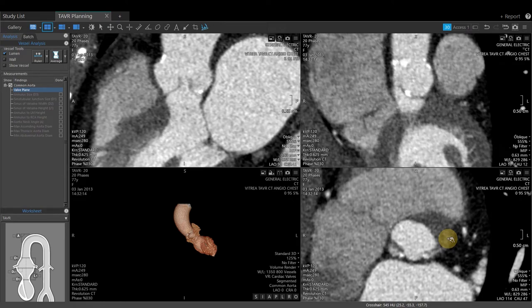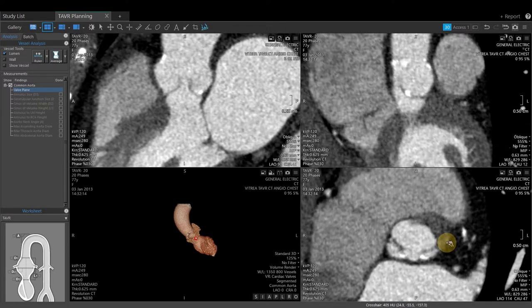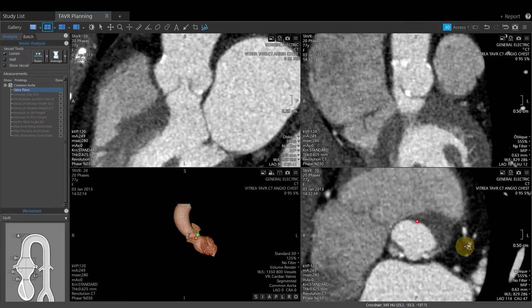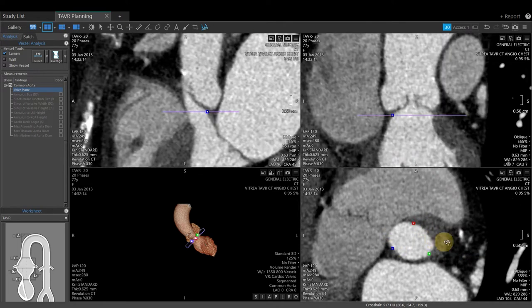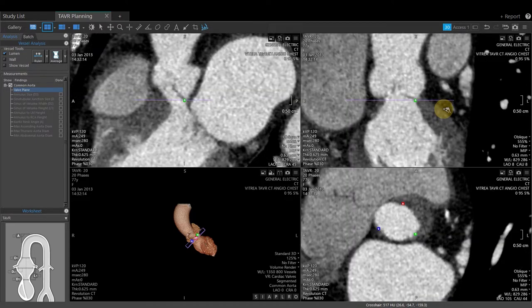Once the valve inserts into the aorta, drop a single click where it disappears by left-clicking. Note the red box in the axial image — red is for right. Then mark the left coronary cusp with a left click, then mark the non-coronary cusp. Once all three points are created, a purple valve plane appears on the MPR images. You can still manipulate the valve plane points by pressing the space bar to toggle through them. To edit any point, left-click and drag. Pressing space bar toggles to the next point.